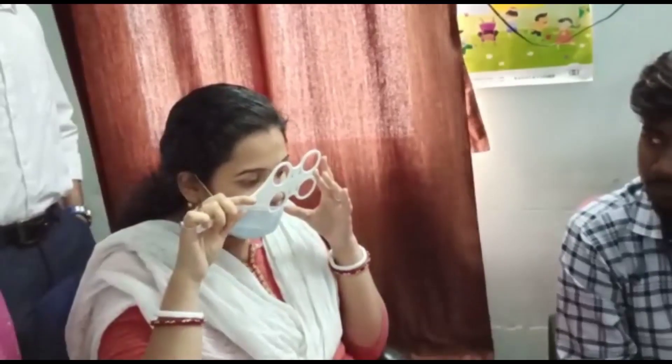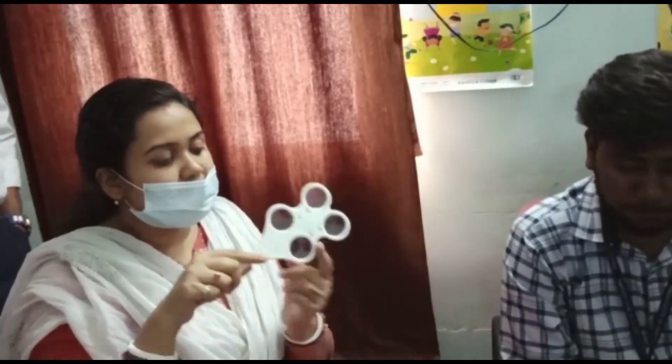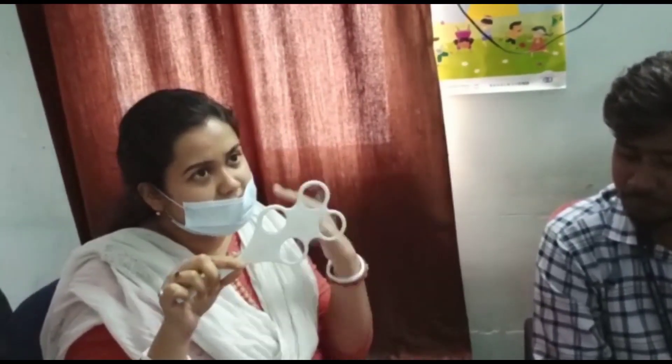So, once I am putting this lens, it is getting blurry. Tell the patient to blink and make it clear. Once it gets clear, you will keep it. And once the patient clears both the +1.5 and the -1.5 onset, that is one cycle. He has completed only 2.5 cycles in one minute time.